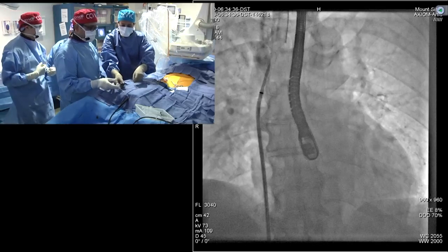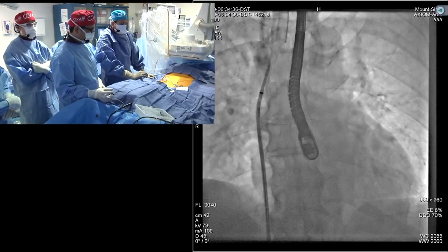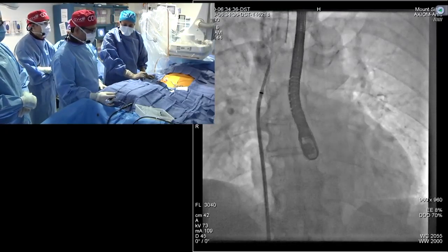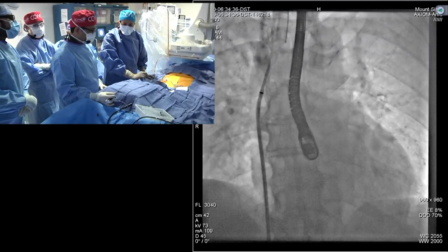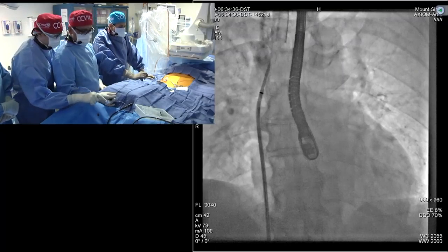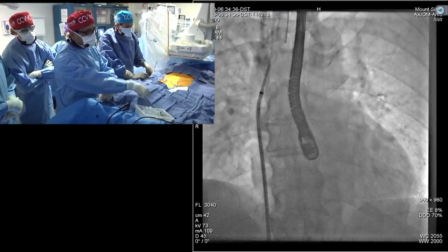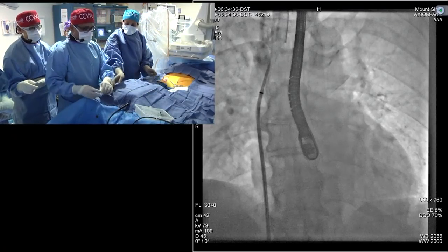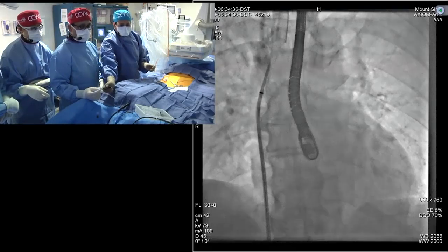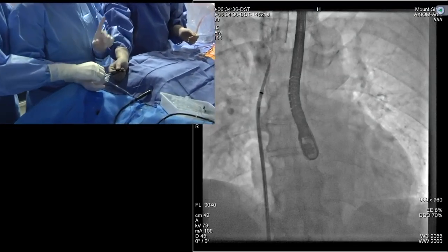That's an interesting point. In the beginning, we never did it, but while you're doing transseptal, since one of the key aspects of the clip is getting the right transseptal, you'll take time and make sure you're at the right spot. It can go anywhere from 5 minutes to 15, 20 minutes. So you have to give heparin, 1,500 to 2,000 units, so there's no clot formation at the level of the septum, and you have the sheath there. Now, what we used is an SL1 sheath, which is already inside, and we have the Baylis needle. It's all flushed. Everything is good.